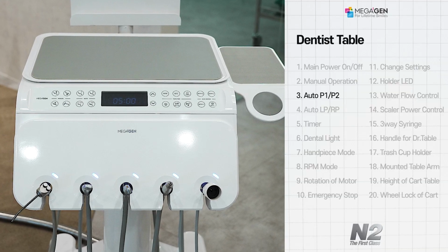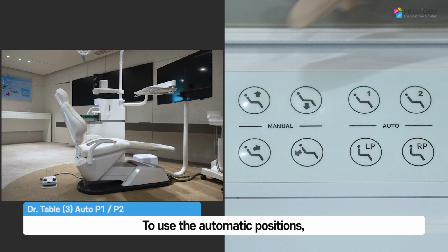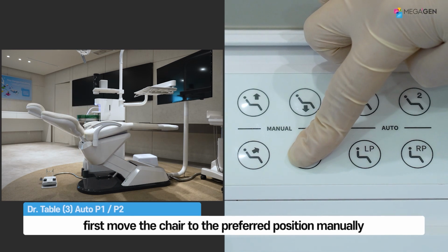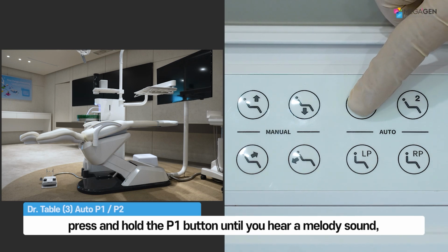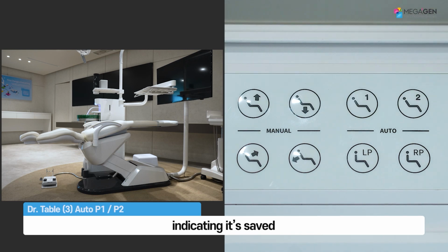Next, let's look at how to save and use the automatic positions P1 and P2. To use the automatic positions, first move the chair to the preferred position manually. If you want to save the current position to P1, press and hold the P1 button until you hear a melody sound, indicating it's saved.